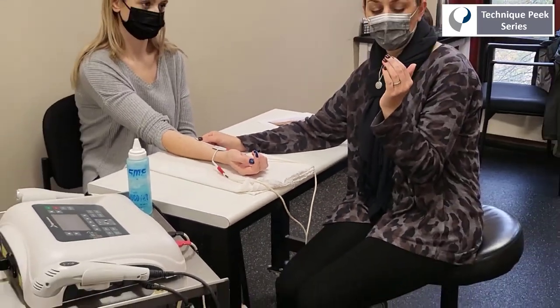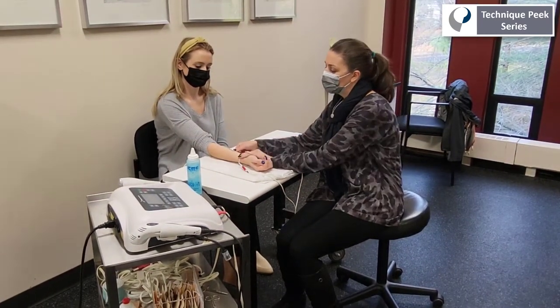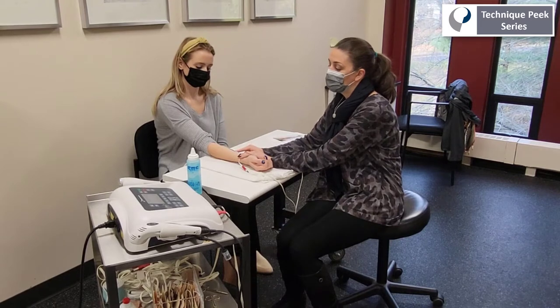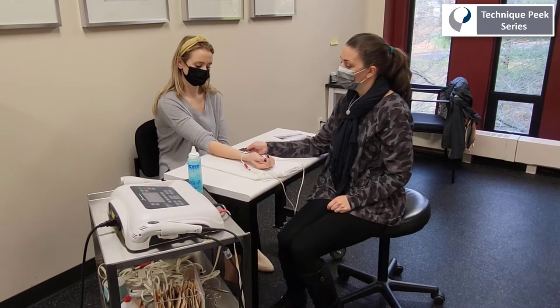But what happens if this patient isn't able to recruit FDS and we're unable to palpate the muscle? When we turn on the stimulation, we may find that we're seeing wrist flexion or thumb flexion instead of that desired IP joint flexion we were hoping for.